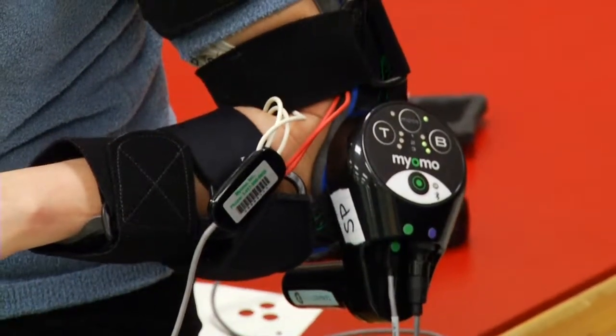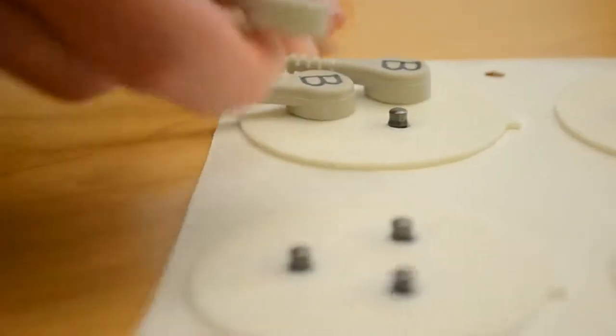According to myomo company officials, results have been seen up to 2 decades after a patient's stroke. Repetition seems to turn on the brain, which is called neuroplasticity, causing the brain to rewire around the damaged area after the stroke and actually restore some movement. It's reading the electrical activity from the muscle, which gets the motor to activate to help them with the motion. The technology is completely driven off of EMG or biofeedback.